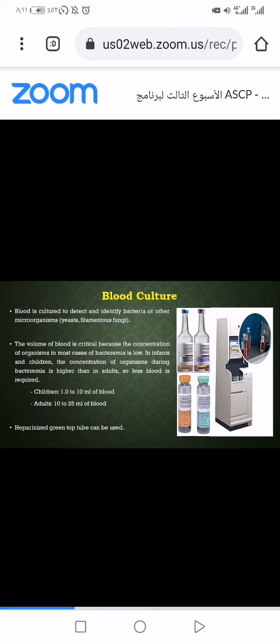البروسيلا. يعني هذا أحد أهم الأشياء اللي انت تعطي بريزنتيف ايدنتيفيكيشن أنها بروسيلا، تحصلها طالعة في داي 3. طيب طالعة من الايروبيك بليت فقط، طالعة تحت المجهر، طالعة شكلها very small gram negative rod. It's very hard to recognize them. حتى تاخذ ستين بشكل غريب، ما تنصبغ زي الناس. فهذه كلها يعني مؤشرات حول البروسيلا.